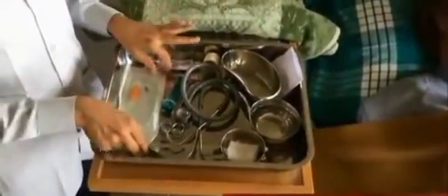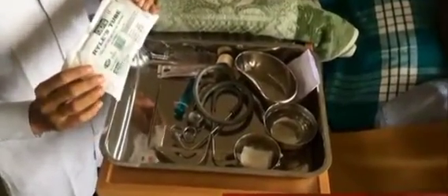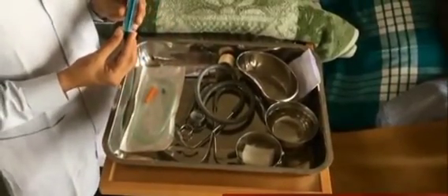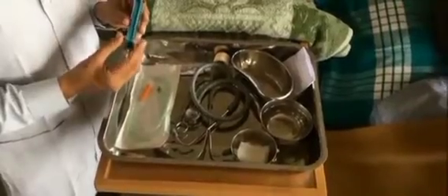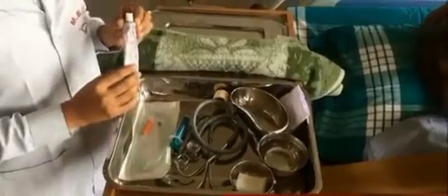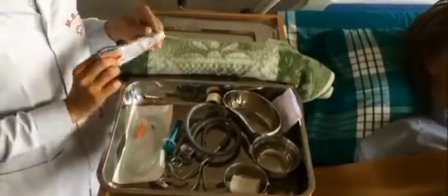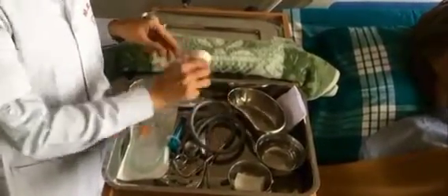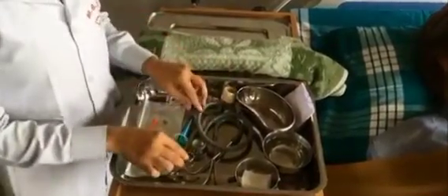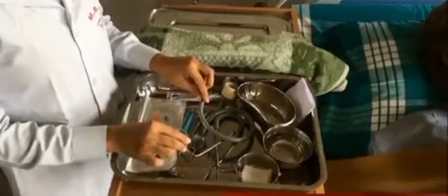Articles for nasogastric tube insertion: a big tray containing Ryle's tube. It is also called a nasogastric tube, for insertion and feeding purposes. A syringe, for aspiration and for checking the placement of the Ryle's tube. Lubricant jelly for lubricating the Ryle's tube tip for easy insertion. Micropore for the fixation of the Ryle's tube. Stethoscope for checking the placement of the Ryle's tube.